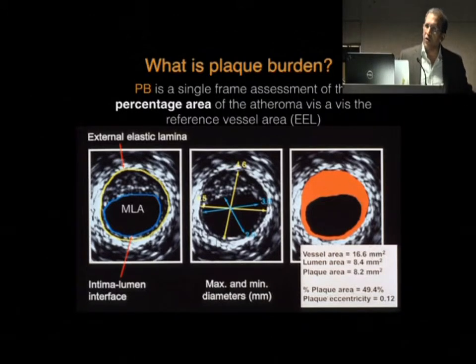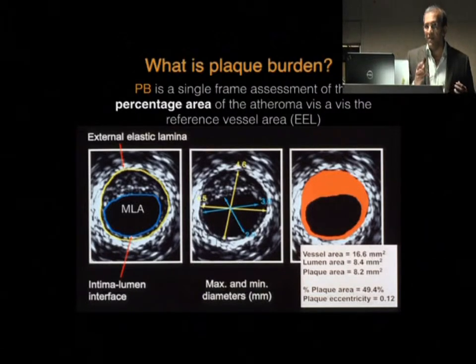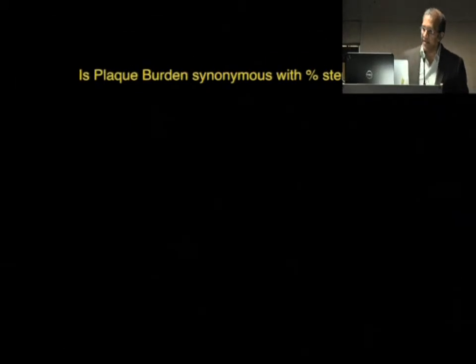This is a very important concept because the plaque burden in our country is very high. What I was taught as a medical student was that our arteries are small. Our arteries are not small. They are overburdened with atheroma, and therefore they appear small on a luminal angiogram. But when we do IVUS, we still see very large arteries with a huge plaque burden. And when the plaque burden is high, it increases MACE rates and TLRs, especially when associated with angioplasty.